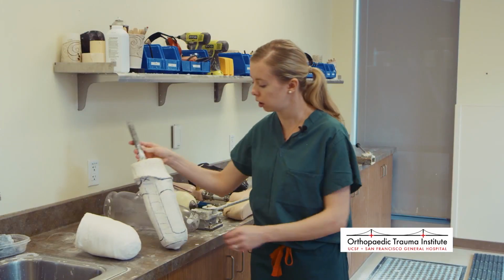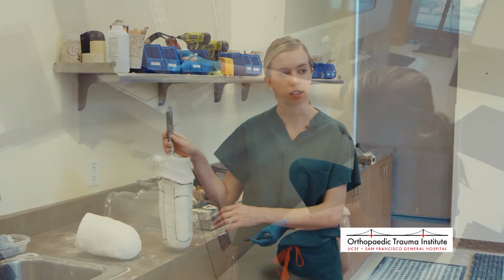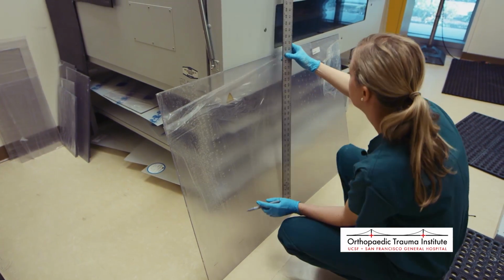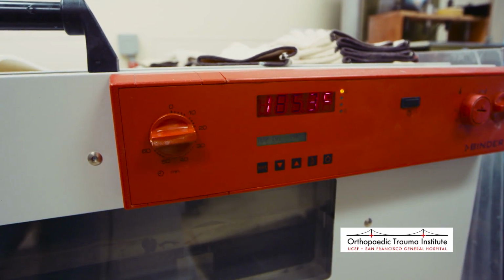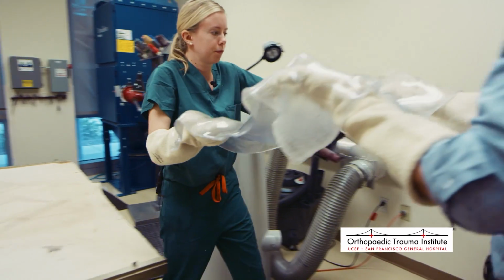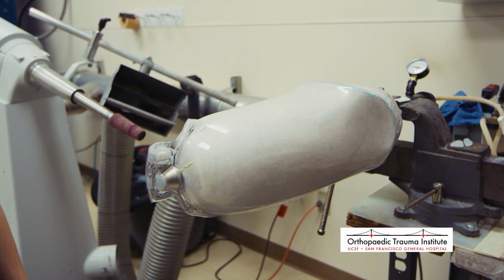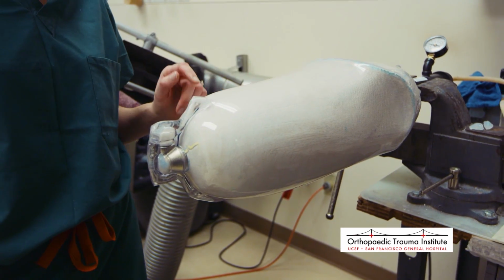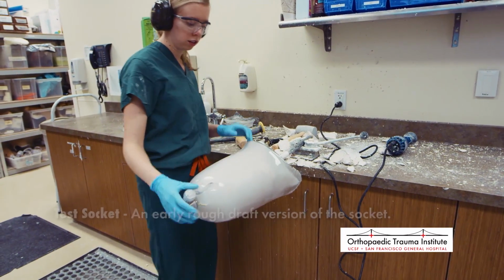A plaster model will more resemble the shape of the limb, and we'll make the prosthesis off of that, the socket. And then once everything's modified and ready to go, then we heat up a sheet of plastic in the oven that will be vacuum formed around the positive model so that it becomes a copy of the leg, so that it captures the shape of the model, so that we have a negative copy of the leg the way we've modified it. That's the test socket. Once we have it copied, we'll break out the plaster until it's a clean, nice socket, and that's what we'll bring to our initial test socket fitting.